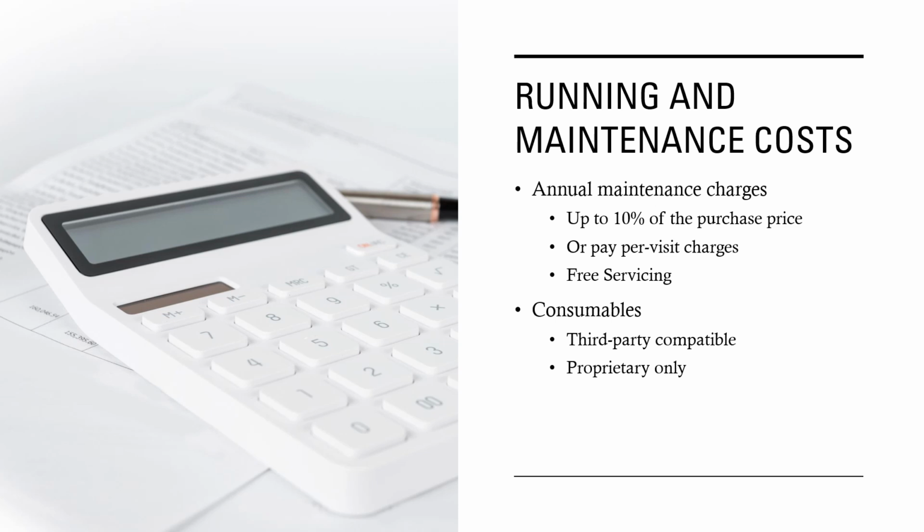The consumables may be third party compatible or they may be proprietary. And just to give you an idea, I would mention here that Medlabs cutter 23 gauge, which is a generic company making cutters for various machines, will cost you something like 4,500 or 5,000, and proprietary cutter for Optikon will cost you something like 13,000. So there's a huge difference the moment you switch to proprietary machines, which may not sound very fair, but this is how it is. So one has to keep this in mind when you are buying your machine.